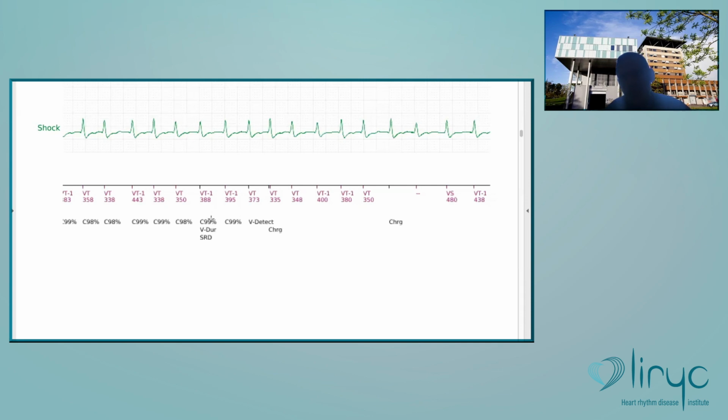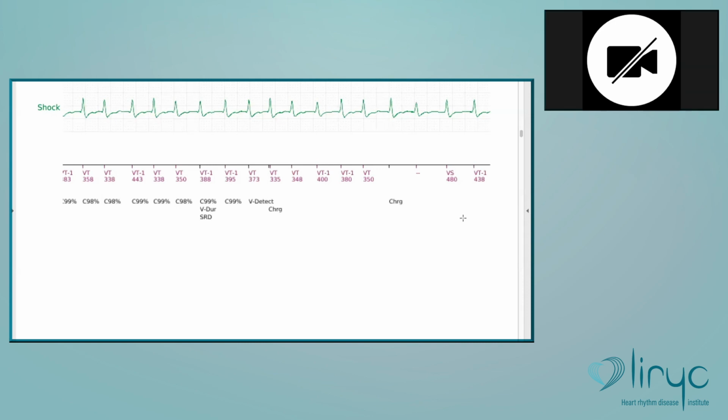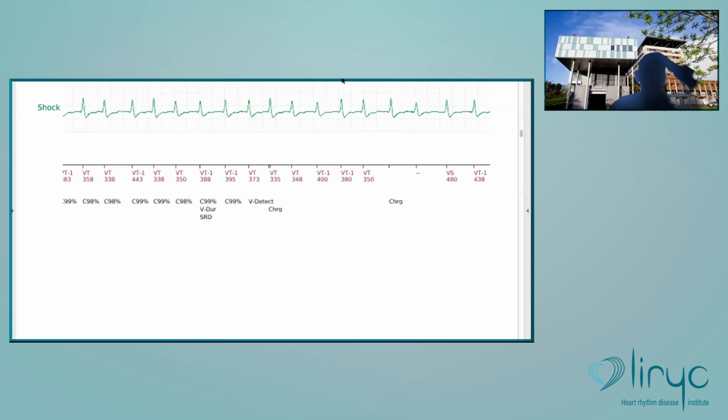Okay, so clearly in the guidelines, there may be situations where you can program it, but at least for all patients initially, I will deprogram this, because if you program it, even if the diagnosis is correct, like here, no doubt that this is SVT, once you've reached the clock, then you will receive the therapy, and in this case, inappropriate therapy. Okay? Questions?